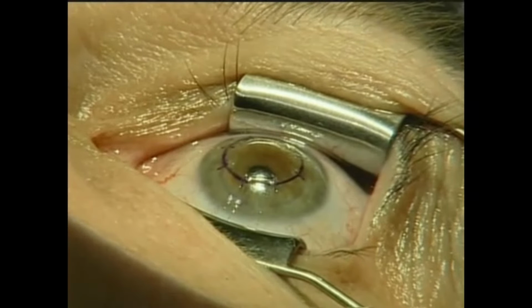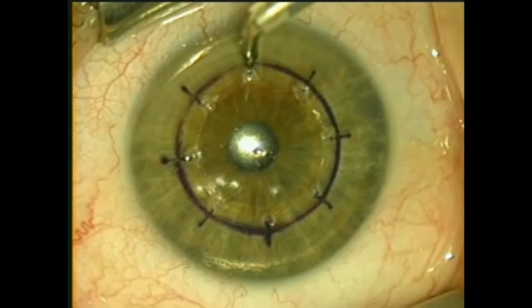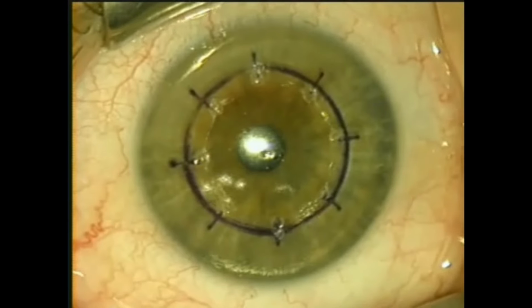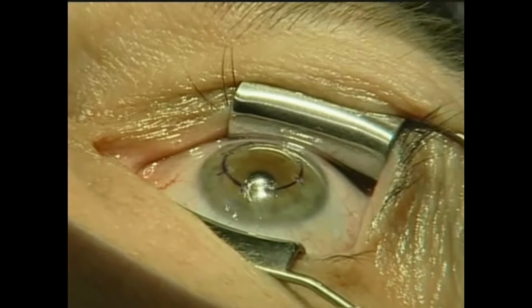the next spot. You can see you really want to press the cornea in a little bit, make sure it's fully in the cornea, and then apply the energy via the foot pedal. Here you go, press and apply. The length of application is preset at 0.6 seconds. Here we go, treating again, and you see the little white lesion. This is again a side view showing the application.